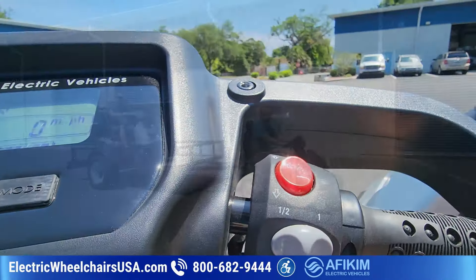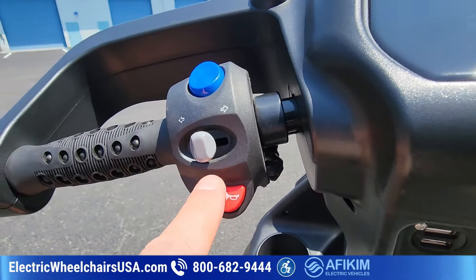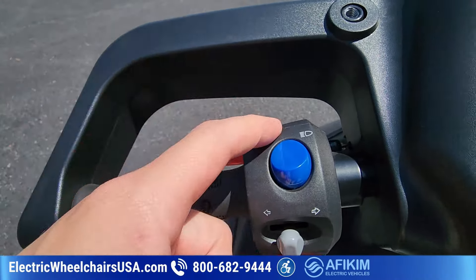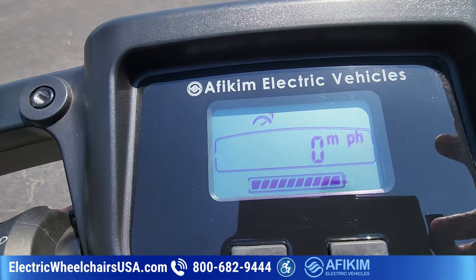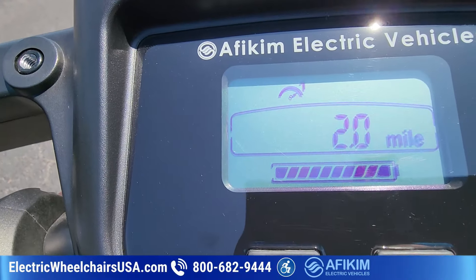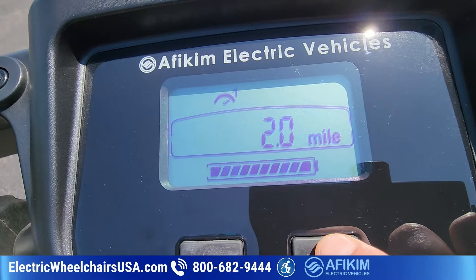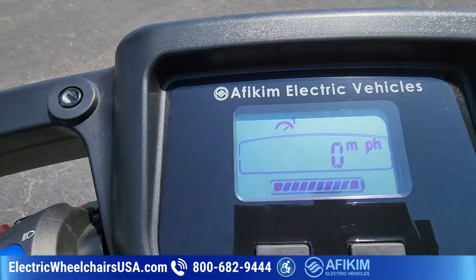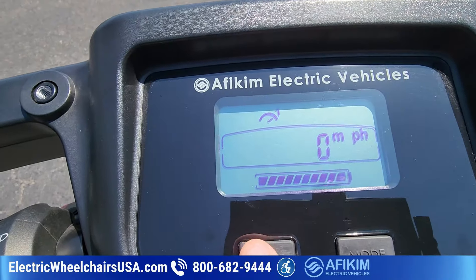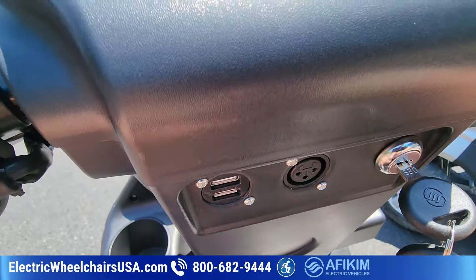You can get a high-torque motor added as an upgrade that increases your top speed to around 13 miles per hour. You also have two horn buttons on each side. There is a headlight button which turns on your front headlight and rear tail lights. You have left and right blinkers, and hazard lights as well. On the digital dash, it displays all the essentials — your battery gauge, and hitting the mode button cycles through the speedometer in miles per hour, your odometer showing how far you've gone, and the time. There's also a backlight button for evening use, and USB charging ports so you can charge two electronic devices.